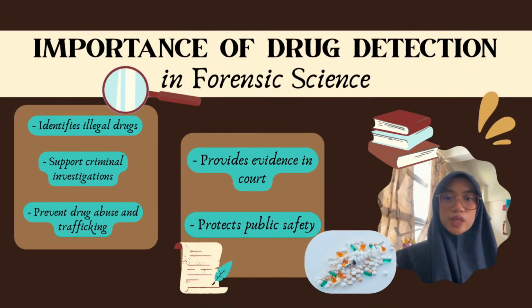Okay, so next we go with the importance of drug detection in forensic science. Do you guys imagine, at a crime scene, how we know whether a white powder is sugar, flour, or an illegal drug? So that's why drug detection comes in.